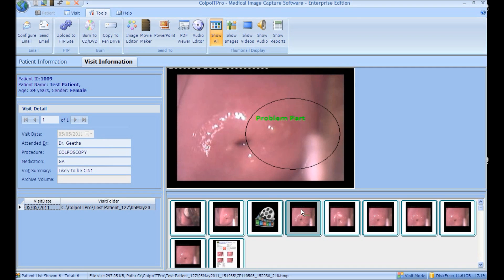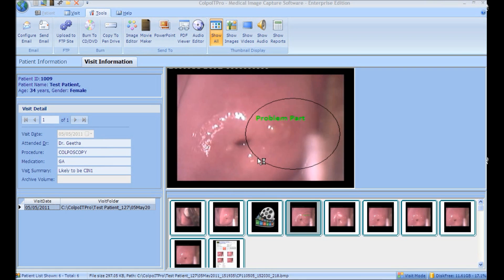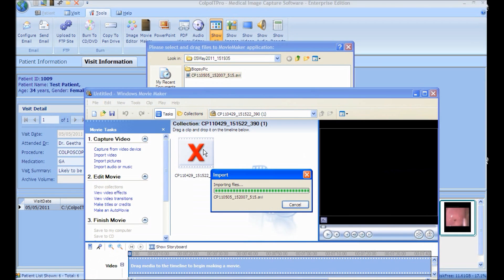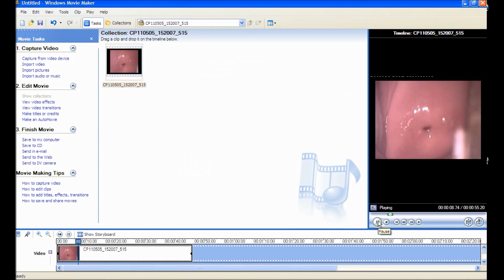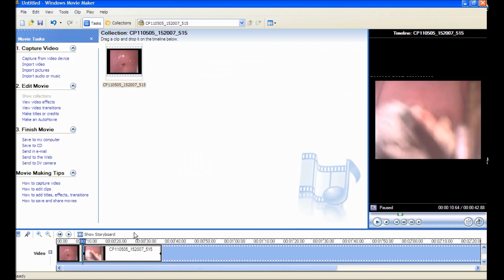Movie Maker: to edit a video, click Movie Maker and click OK. The application opens the corresponding patient folder. Drag the video to be edited into the Movie Maker application. You can split the video and delete unnecessary clips. After editing, click Save to My Computer.